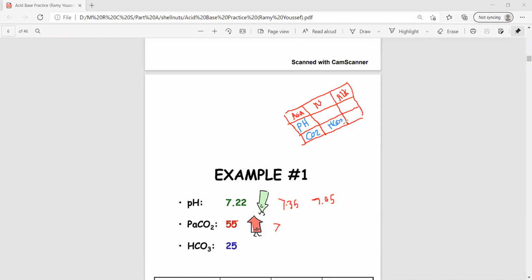So what is the problem here? The respiratory acidosis. Easy way. Just write acidosis, normal, alkalosis. If you can't make it with your mind, make this table always. And you'll find the parameter will be written under the pathology. So if CO2 is here, the pH is in acidosis due to CO2, so this is a respiratory condition. If I found HCO3 below this, this is a metabolic acidosis.